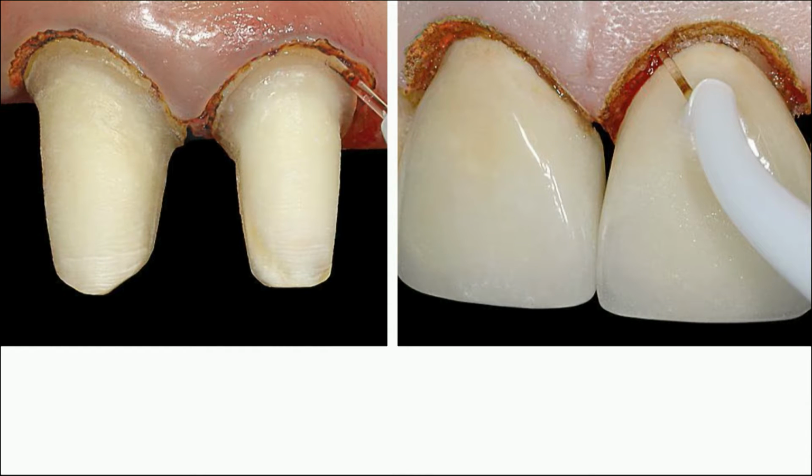The tissue discoloration we can see on that image, how long would we tell the patient to expect that to persist? I always tell the patient it's going to look brown with tiny black dots for about 3 or 4 days. Oral mucosa will normally begin to migrate over that at roughly 1 to 2 millimeters a day. So if it's a very small thing like a gingival crevice, that will basically turn pink in a couple of days. And I'll tell the patient, once it's turned pink, wait 1 day and then you can begin to brush it gently, because you've now got a covering of epithelium or mucosa back on the surface. But initially we want patients to leave that brown layer there, because that's actually the wound dressing or the bandage. It looks a bit ugly.